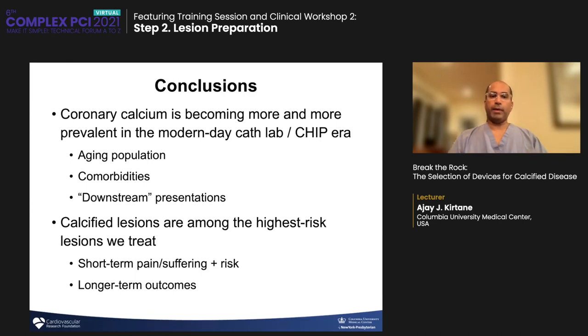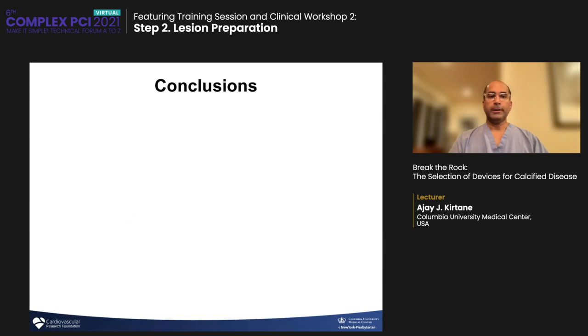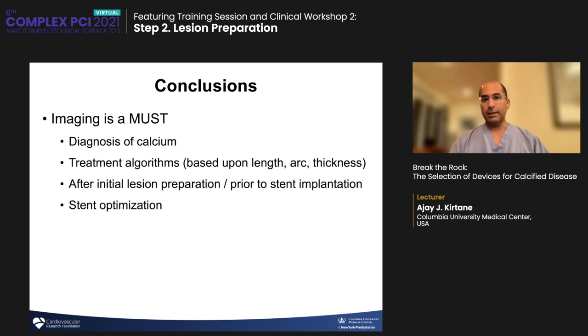They cause short-term pain, suffering, and risk during the procedures. And they're also associated with worse long-term outcomes, as I showed you before, restenosis and stent thrombosis. Now, imaging is a must. My statement on this is that if you don't image, you don't know what you're dealing with. So number one, you could not diagnose calcium. And number two, you would potentially misdiagnose the type of calcium.